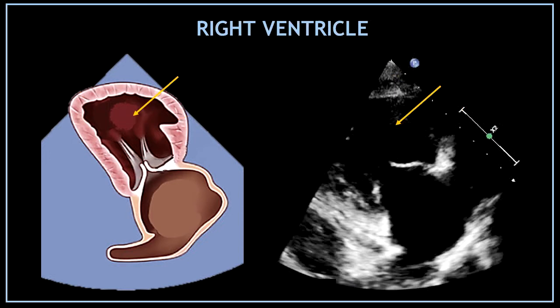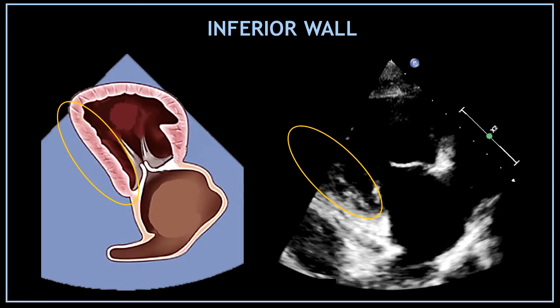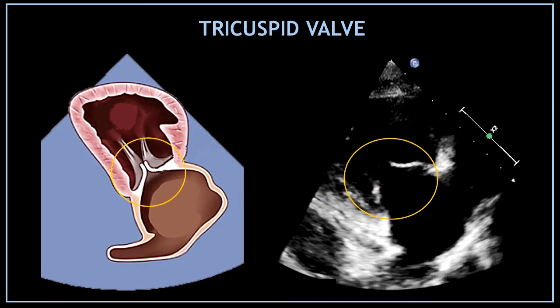Next to the wall we have this big echo-free space at the top of the view. This black space that looks a bit triangular in shape is the right ventricle. The next wall we can visualize here corresponds to the inferior right ventricular wall.